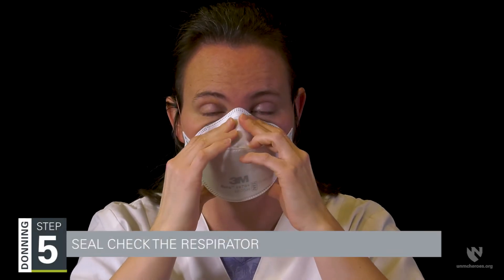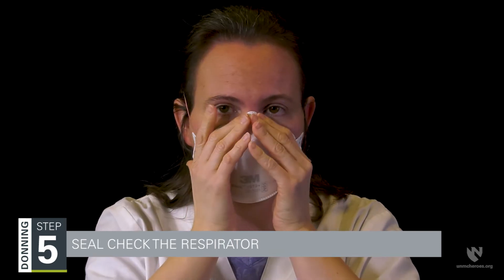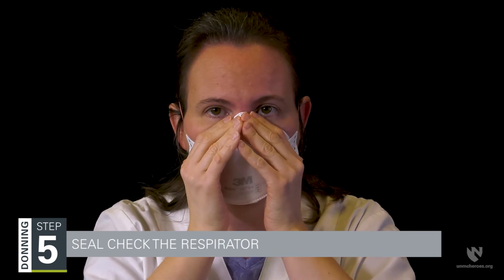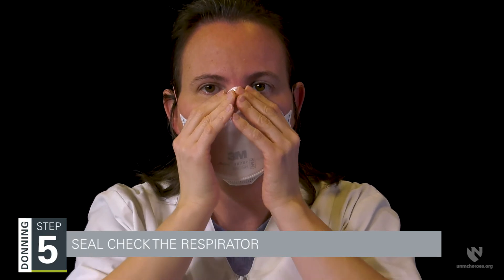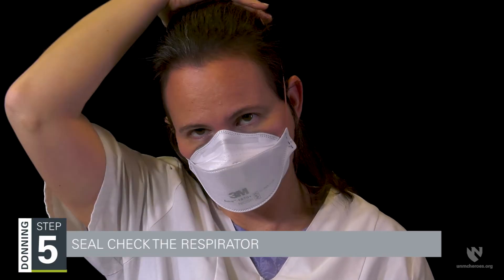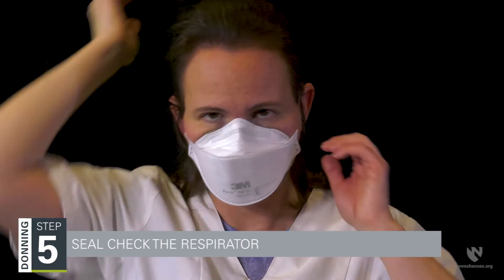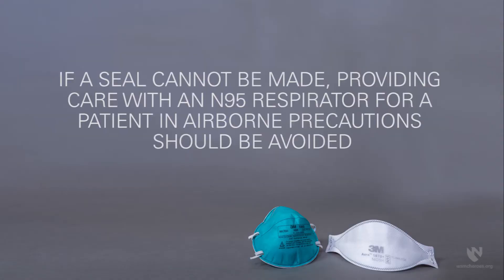If your respirator fails the seal check, refit the respirator nose clip to your face using both hands and perform the seal check again. You may have to readjust the respirator straps after refitting the nose clip. If a seal cannot be made, providing care with an N95 respirator for a patient in airborne precautions should be avoided.